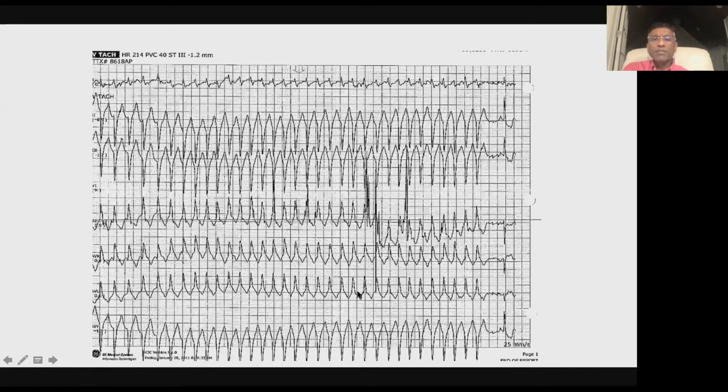I think if you followed this out, I don't think there's an exact pattern to match it, but every now and then there's a candidate for a P wave. There's a little notch there. And so again, this suggests AV dissociation. It's not a one-to-one association of the P and the QRS, and the V is going faster than the atrial rate. I can't show you any other P waves nearby to show you that the V is definitely faster, but you'll have to take it from me.